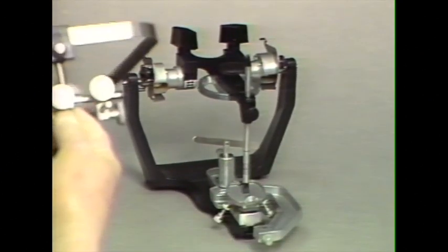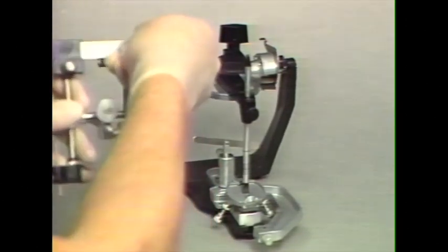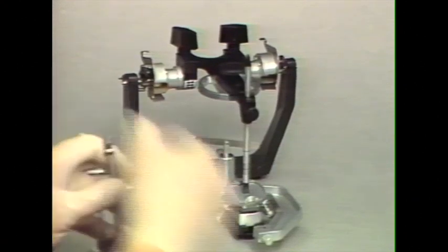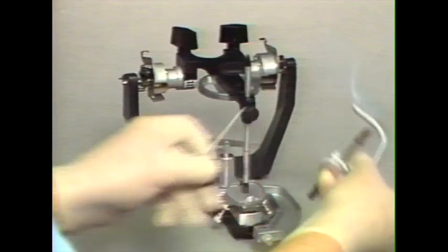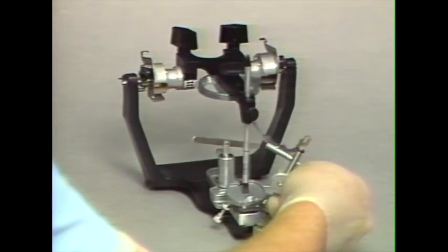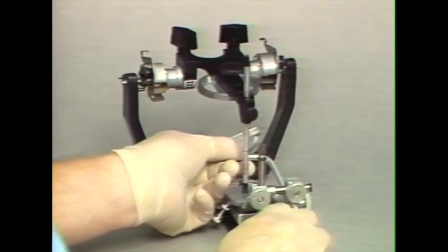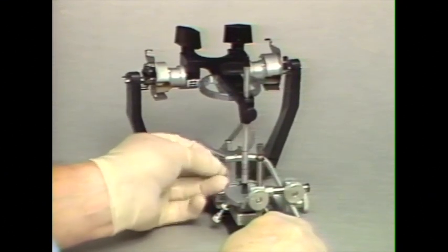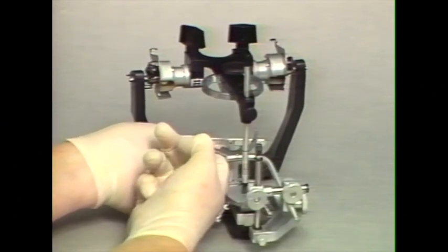And we can detach this mounting clamp assembly from the Facebow itself, and that is attached. We have to remove this elevating rod to attach it to this anterior receptacle in the mounting platform. The cast support then can be brought into contact.